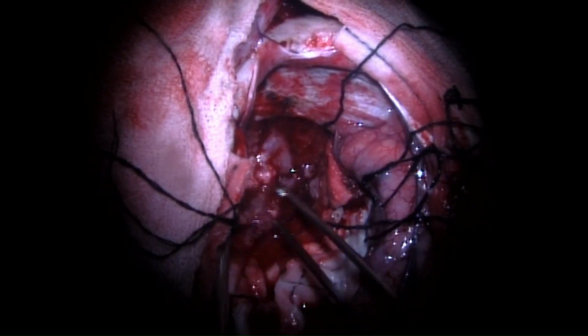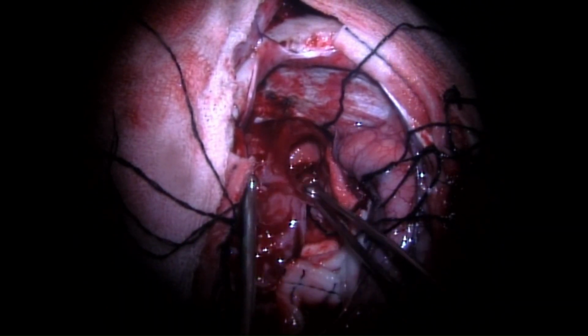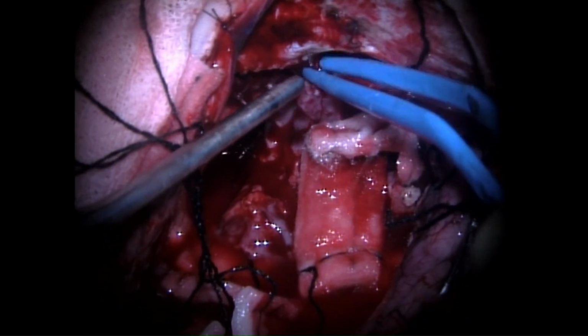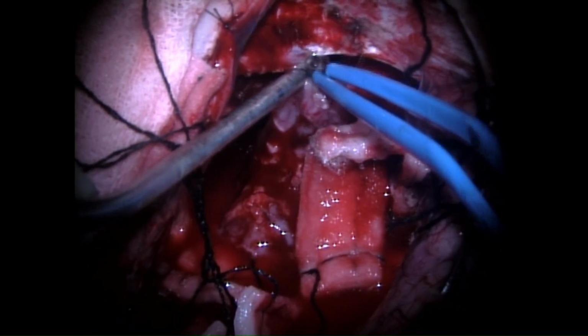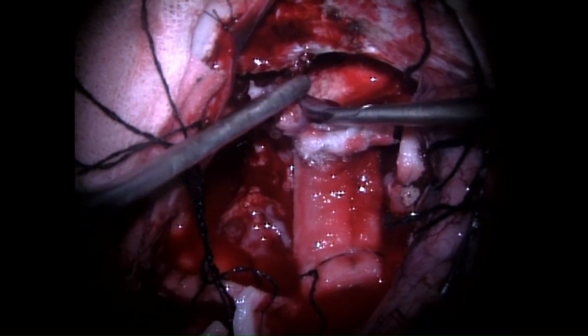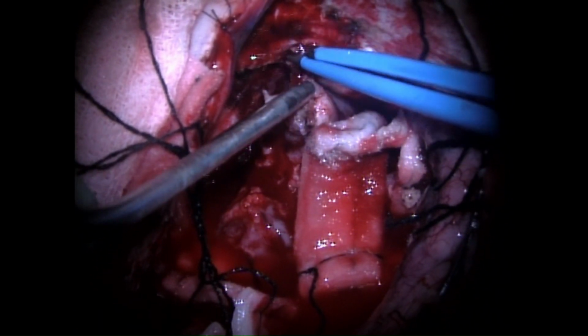Again, the tumor was delivered from underneath the falx, and this is the last part of the tumor as its attachment is being coagulated and cut in the region of the inferior sagittal sinus.